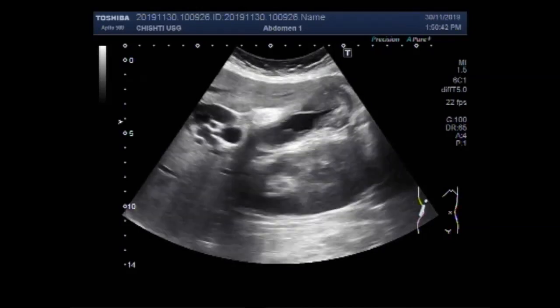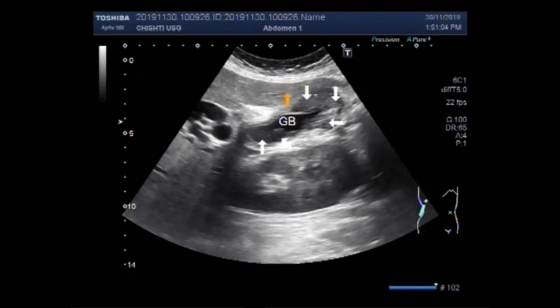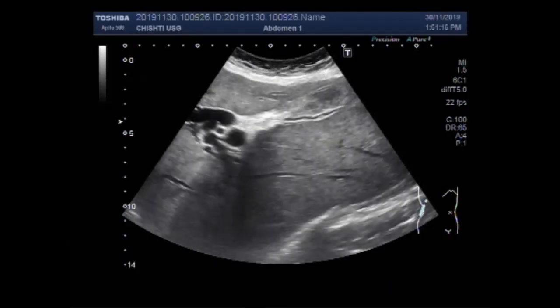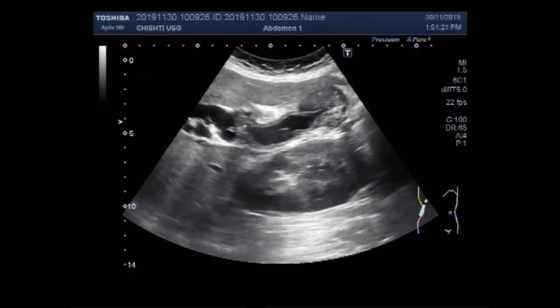Now you can see the gallbladder and a significant amount of thick sludge is seen in the body, and there is thickening of the gallbladder walls. This thick sludge is seen in the body of the gallbladder, but you can see there is no stone seen in the gallbladder.